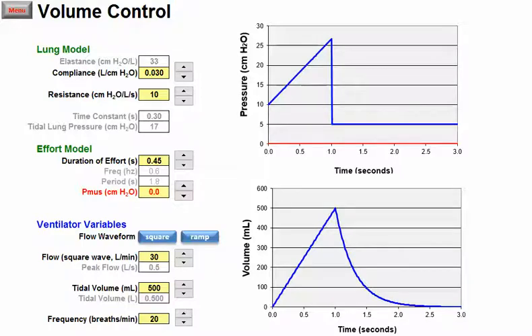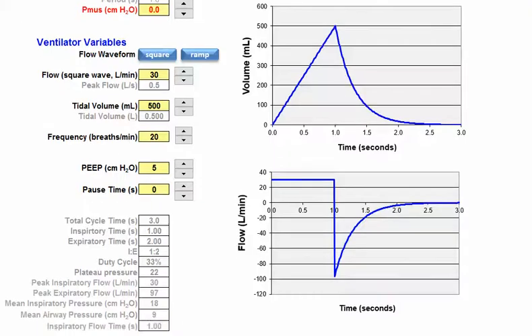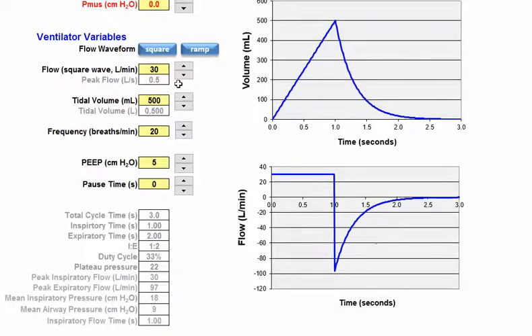The next added functionality is now I have a choice between a constant flow waveform pattern which is my square, or a ramp or decelerating. So this is new to the functionality. At first we only had the square waveform.